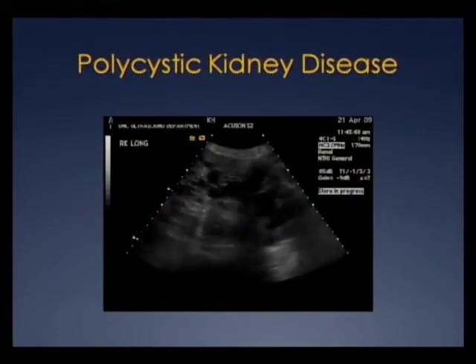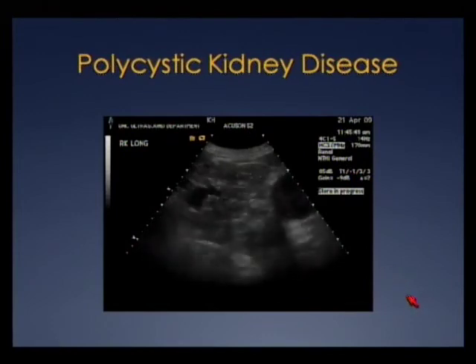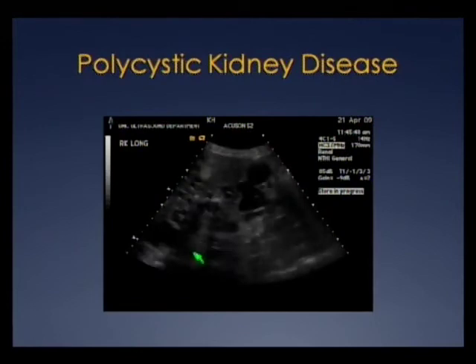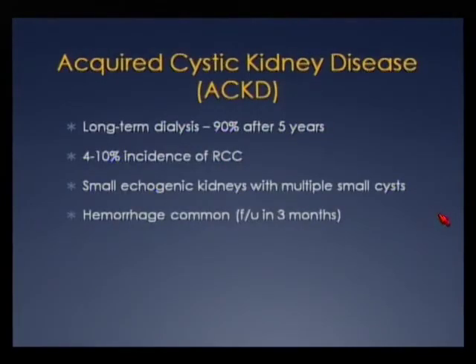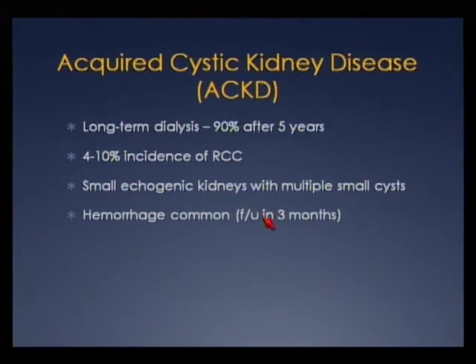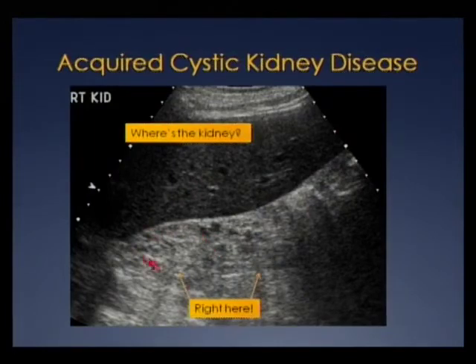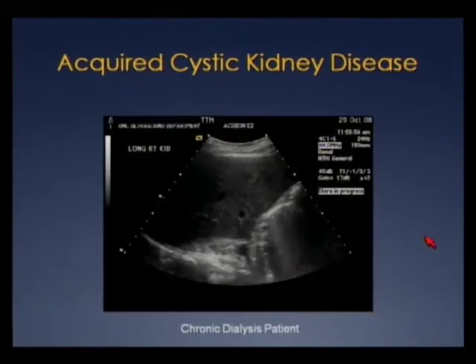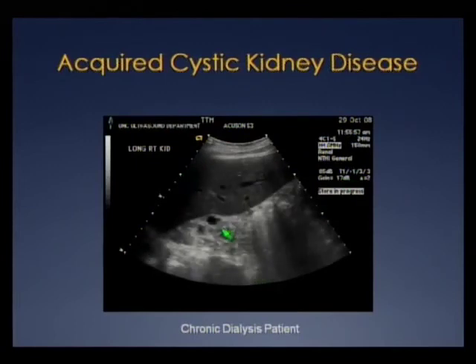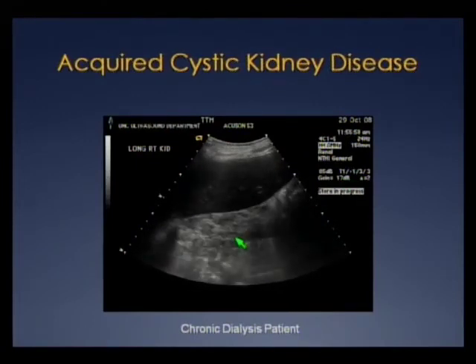In acquired cystic kidney disease, the kidneys are often very difficult to see — hiding in the background of fat. The cine images may help you better identify the kidney and the cysts within it.